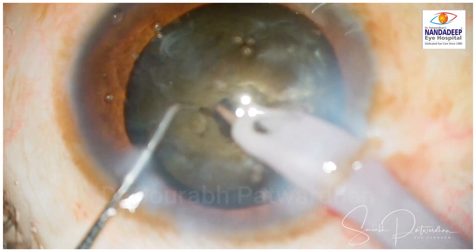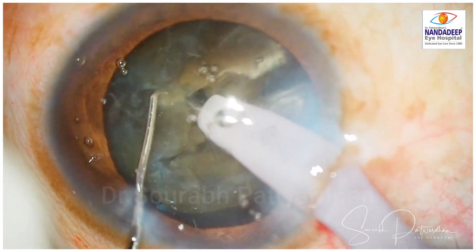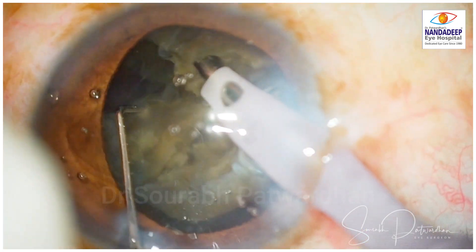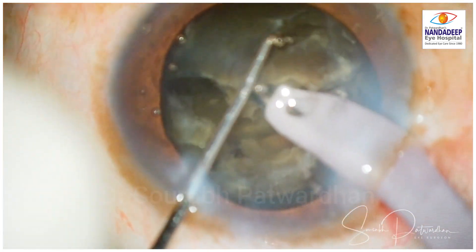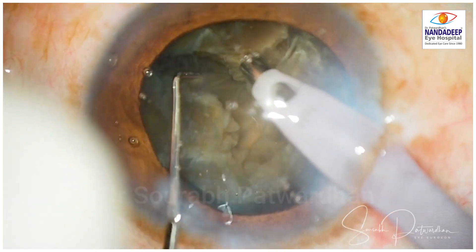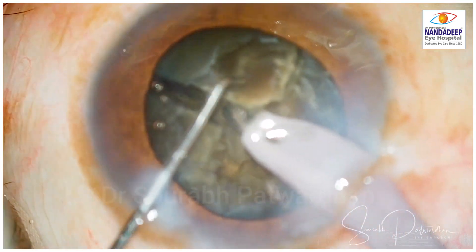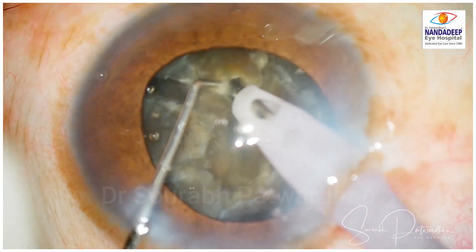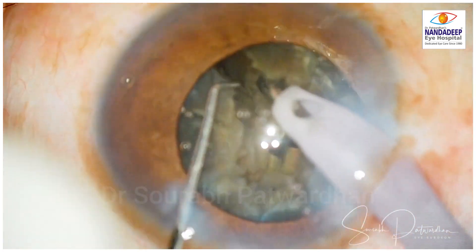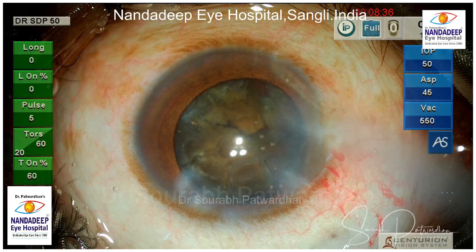The important thing when you split is to try to split till the posterior plate for complete separation. I am using a 1.5mm long Sinski here for chopping the nucleus. These brown-black cataracts are always tricky because you have to be very careful in dividing them — you have to protect the endothelium.